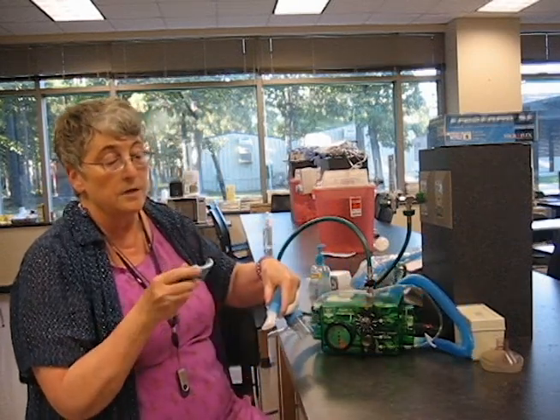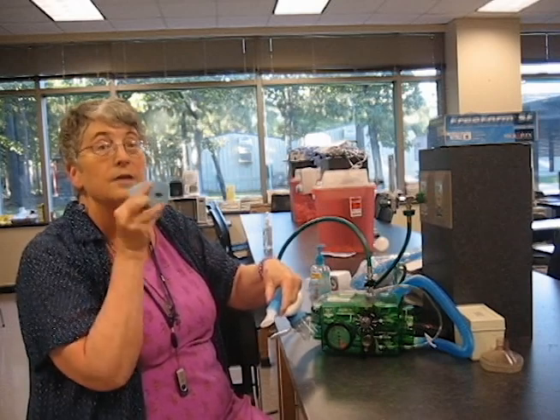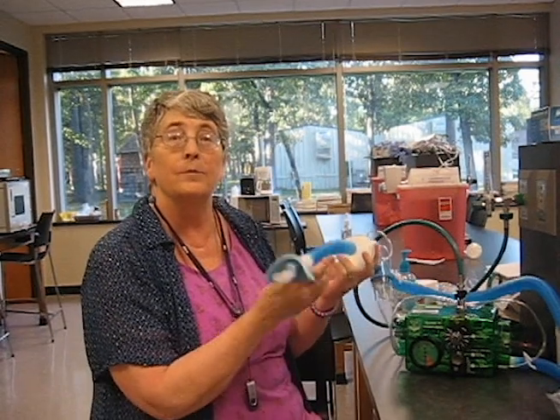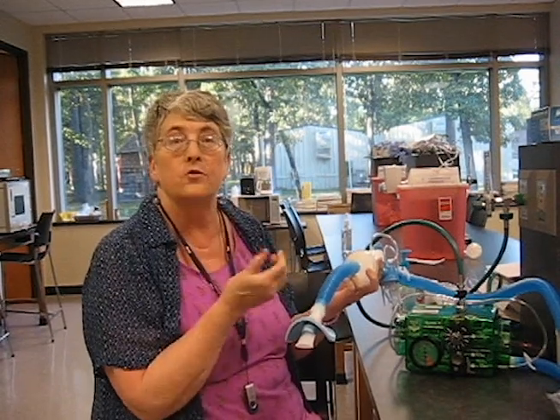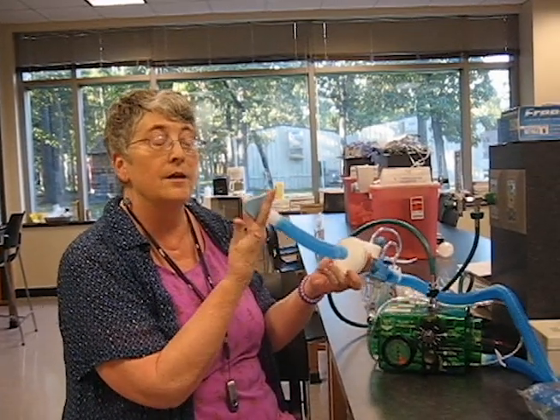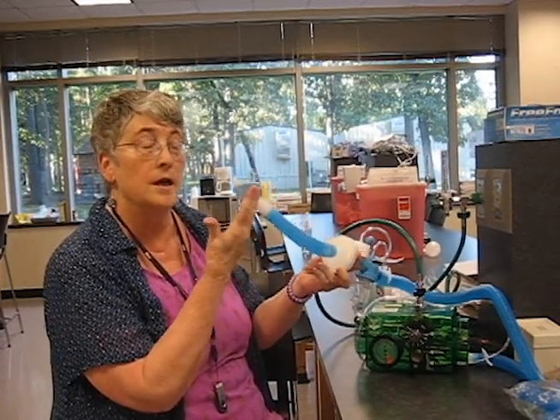This device is going to go on to where it faces the patient like this. When my patient can't put his lips around the mouthpiece — like say he's stroked out — we can use what's called a mouth flange. I'll put this around and support it with my fingers to press tightly around the lips.